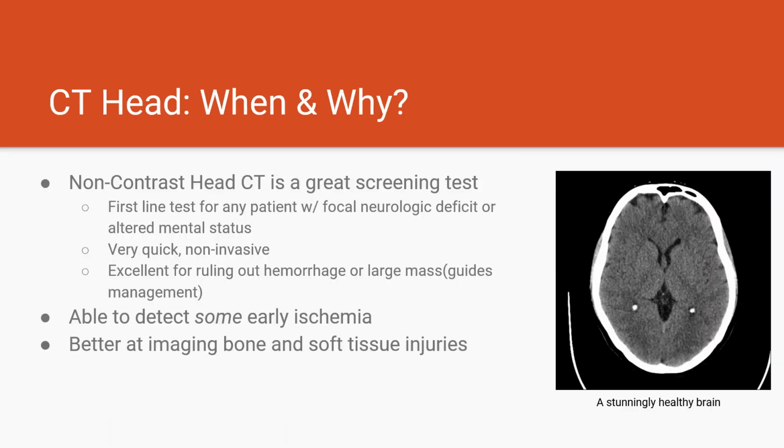So the first imaging modality we're going to talk about is the infamous head CT. You're going to see this on pretty much every patient who comes through the neurology service, usually ordered reflexively in the ED because they have neuro something going on, but it's really a common and important test to know. This is because the non-contrast head CT is an excellent screening test, really, that needs to be ordered anytime a patient has an acute neurologic change.